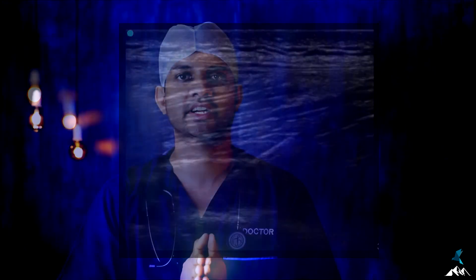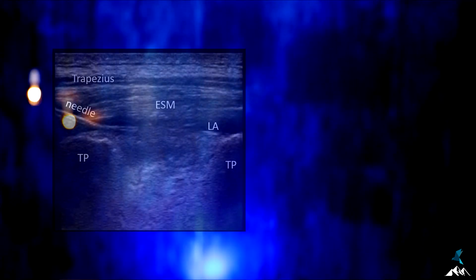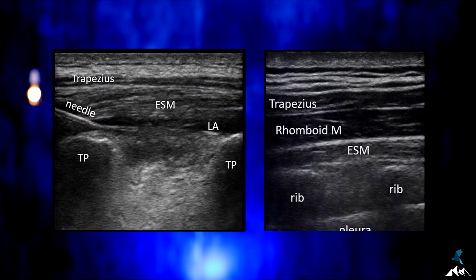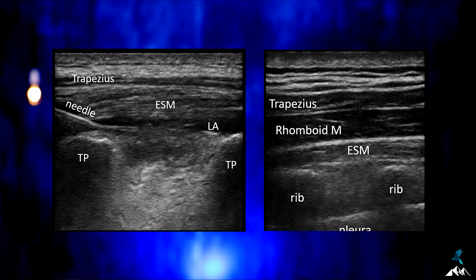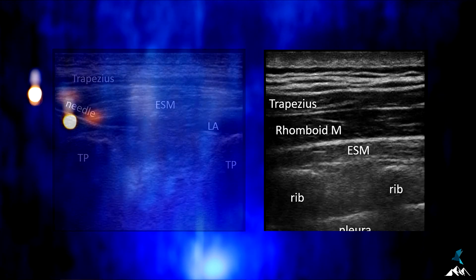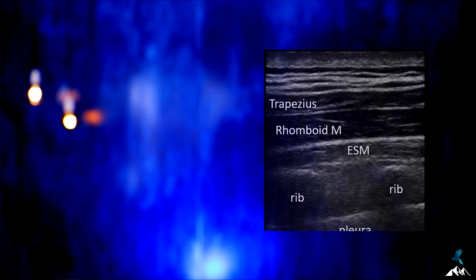In the parasagittal scan for erector spinae plane block, especially at the thoracic level when scanning laterally, there can be confusion between the transverse process and the rib. As seen in the image, the transverse process will be more superficial and more square-shaped. The rib will be deeper compared to the transverse process and more round in shape, and there will be an intervening pleura at this level.